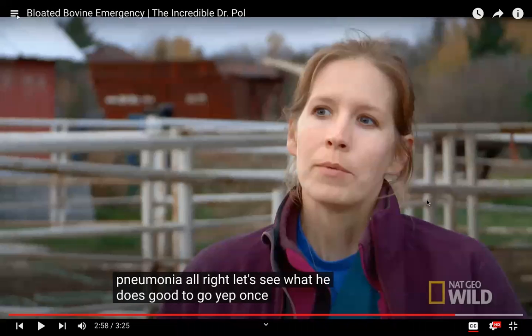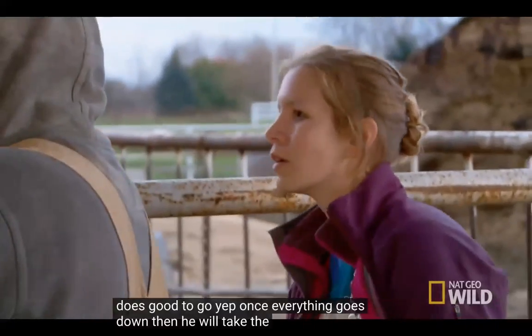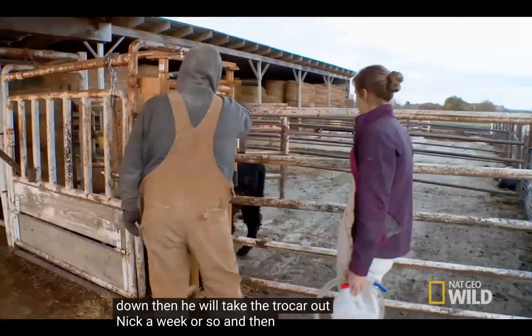Again, using these cattle chutes to treat those patients. We're not just going to treat cattle standing next to us on a halter like we would a horse, always putting them in the chute. Once everything goes down, then he will take the trocar out in like a week or so, and then it'll just heal back on its own.